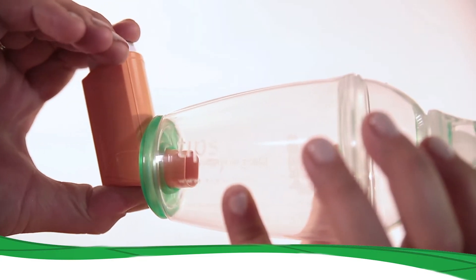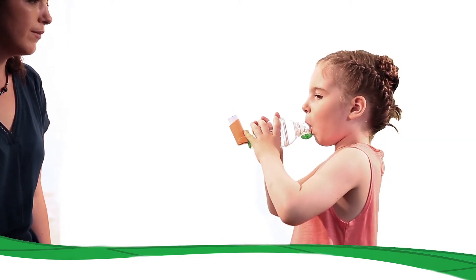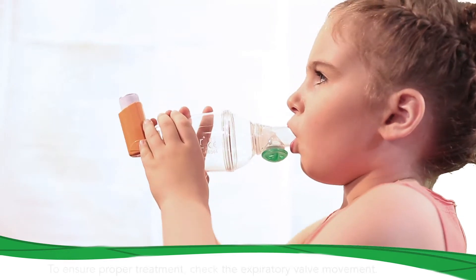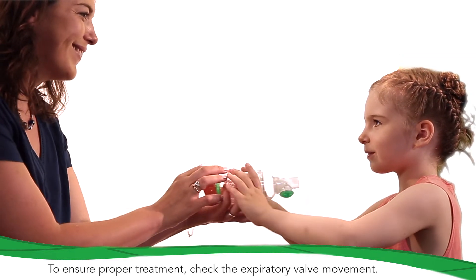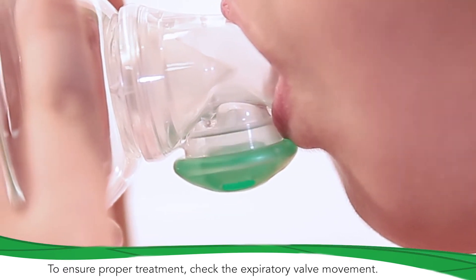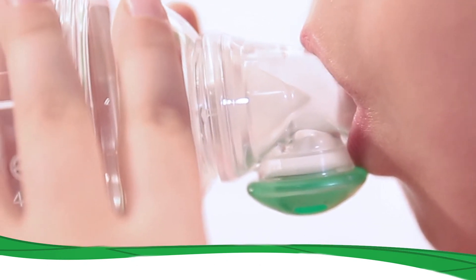Press on the metered dose inhaler to release a puff of the drug. Let the child breathe five or six times during inhalation. Check the correct inhalation of the drug through the expiratory valve movement. If necessary, repeat the process according to your doctor's prescriptions.